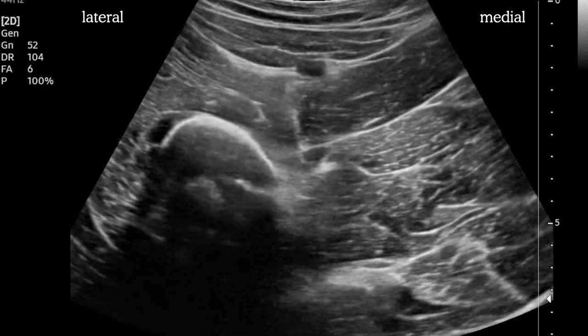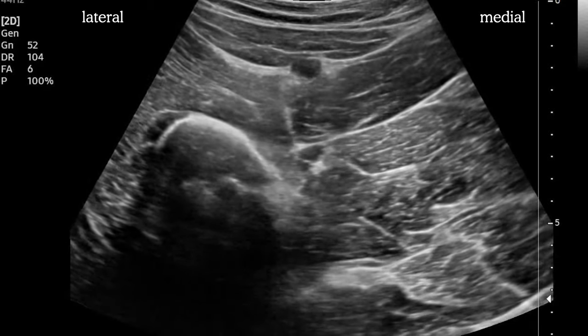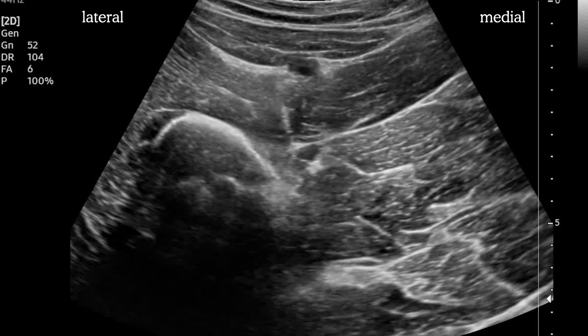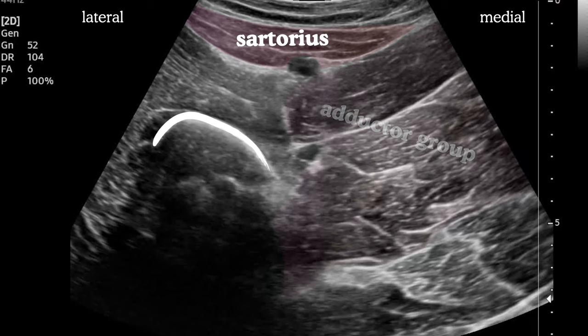Here's what our scan will look like. Our first obvious landmark is the femur, with its hyperechoic surface casting a large acoustic shadow. We see sartorius near the surface, with a superficial femoral artery centered beneath it. Deep and medial to that is the adductor group of muscles. Depending on your exact position on the thigh, you may be able to see two or three distinct muscles, but it's not critical to identify each one.